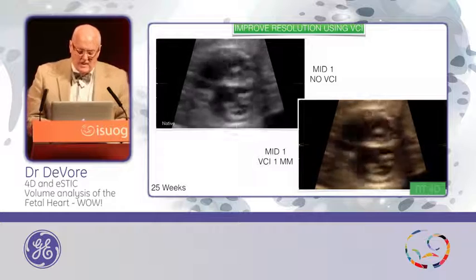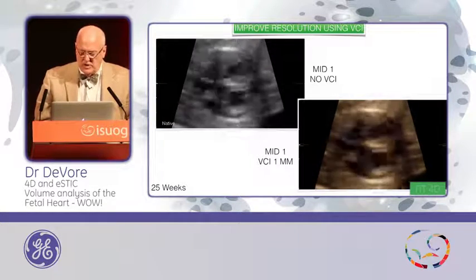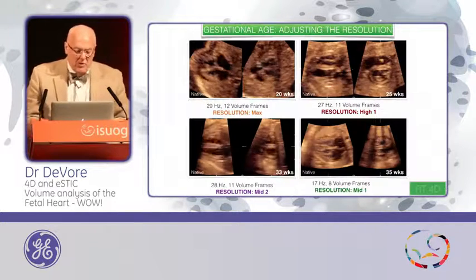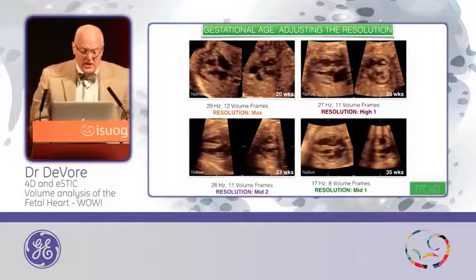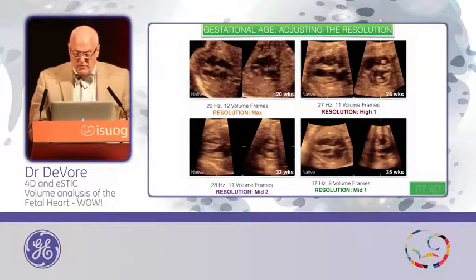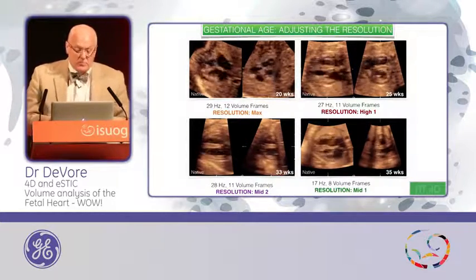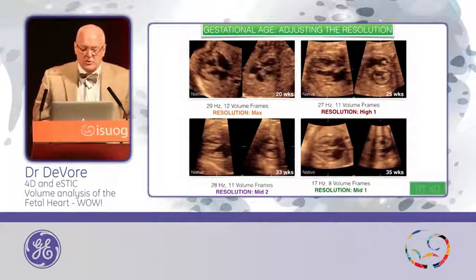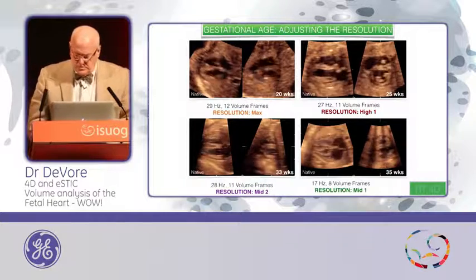We can also enhance the image with VCI, giving a little bit more detail in the valve motion and the walls of the heart. This demonstrates that over the gestational age periods — whether you're 20, 25, 33, or 35 weeks — the image resolution is really excellent, and we simply adjust the resolution to maintain the frame rate in an appropriate range for diagnosis.